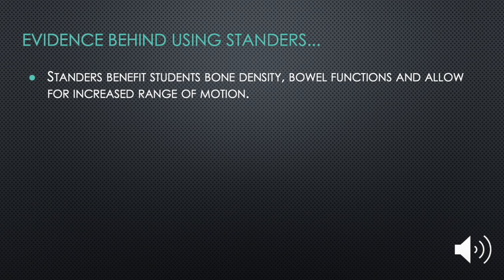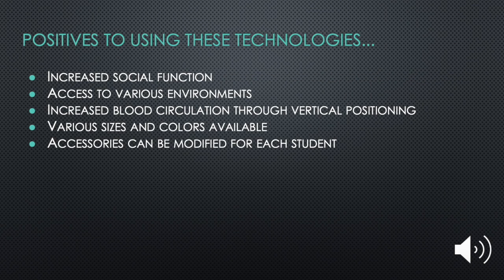The evidence behind using standers. Standers benefit students' bone density, bowel functions, and allow for increased range of motion. And so if you think about it, students with physical disabilities are typically in wheelchairs and in a sitting position for the majority of the time they're in school or in their daily lives. And so these standers really are beneficial for students to get them up and moving around and getting that blood flowing. It's really great for students to be able to be in a different position than just sitting all the time. It's necessary for students.